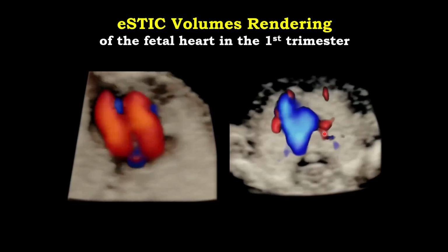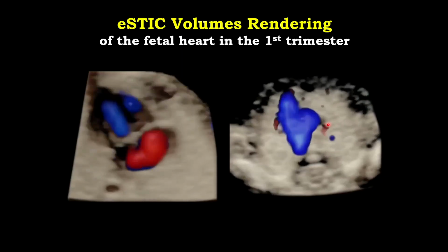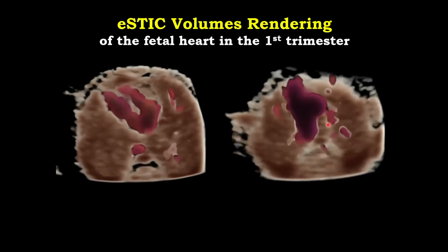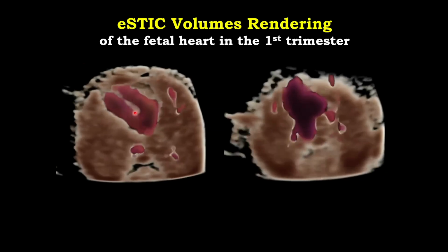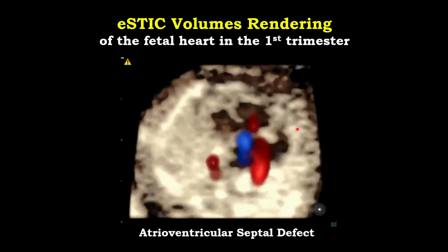I would like to highlight that here we can visualize such tiny vessels as the internal thoracic arteries as early as 12 weeks gestation. So this is a really sensitive method. We can use different presets of color in order to highlight different anatomical structures. Here we have the main focus on the interventricular septum, and here we are focusing on the 3-vessel and trachea view. And just a few examples of pathology.